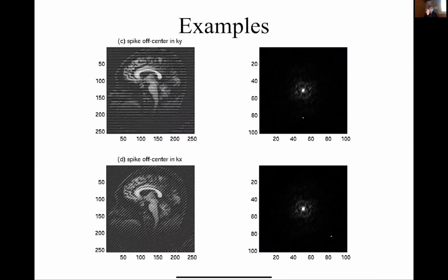This also happens a lot because the systems tend to vibrate, and we'll talk about that in a minute, but sometimes even just little metal pieces hitting each other once in a while can cause a spark. So as you're going through Fourier space, once in a while you might get some spurious energy that just pops into your acquisition.